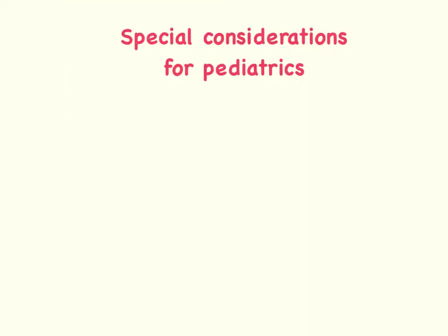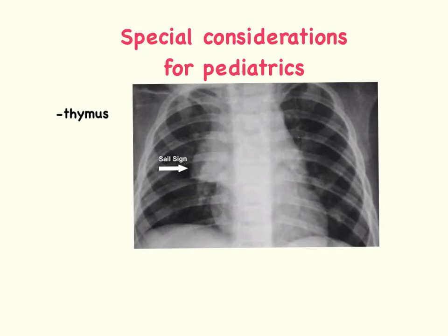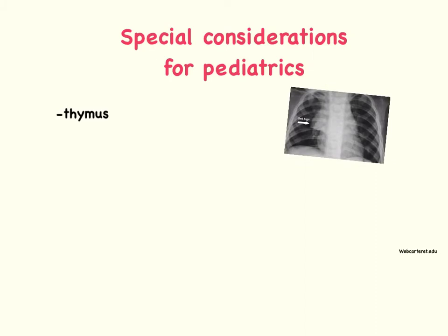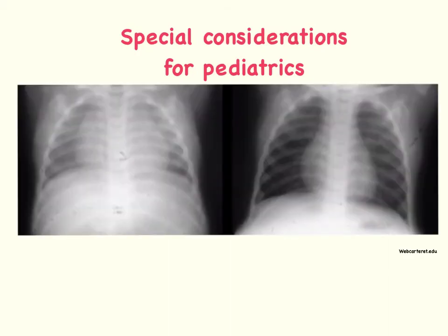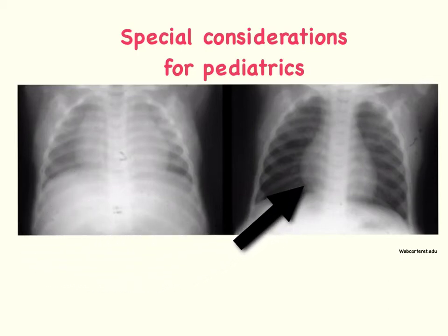As we all know, children are not just small adults, so there are certain things to consider when evaluating a chest x-ray in a child versus an adult. One thing to evaluate is the thymus or thymic shadow, which can be visualized in the right upper area of the chest — called the sail sign on x-ray — and can be confused with an enlarged heart, atelectasis, or pneumonia. Also, chest x-rays show the best quality on an inspiratory film; however, smaller children are unable to follow commands, so you may get an expiratory film, which can make the heart appear enlarged, as seen in this example comparing expiratory and inspiratory films of a neonate.